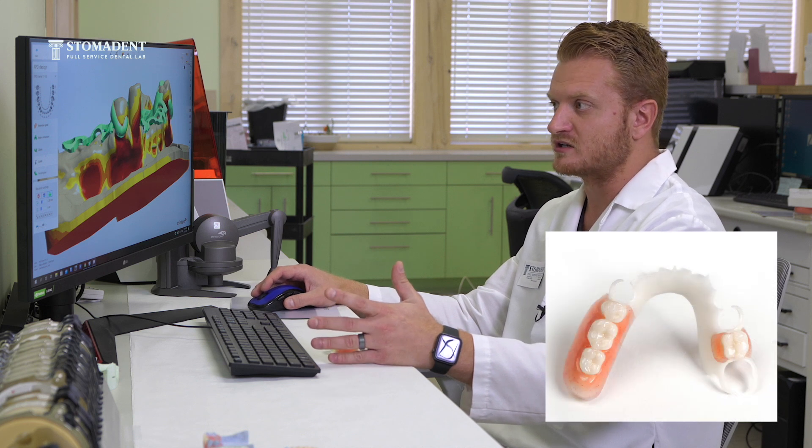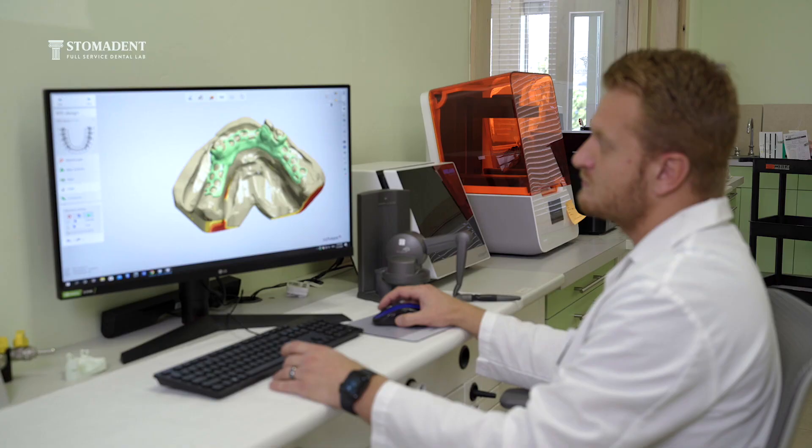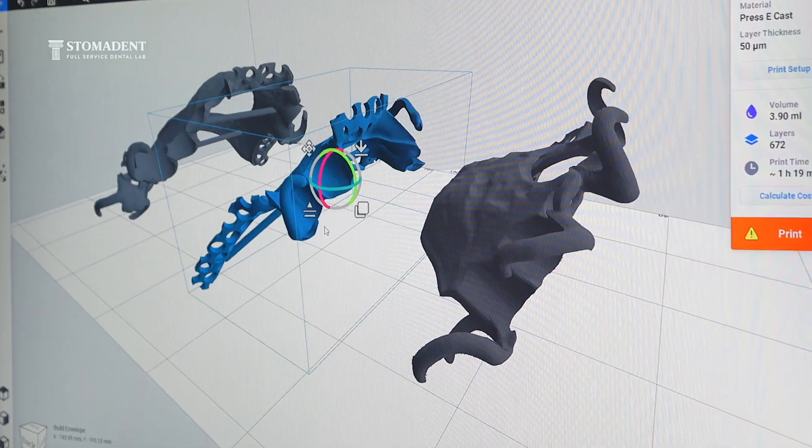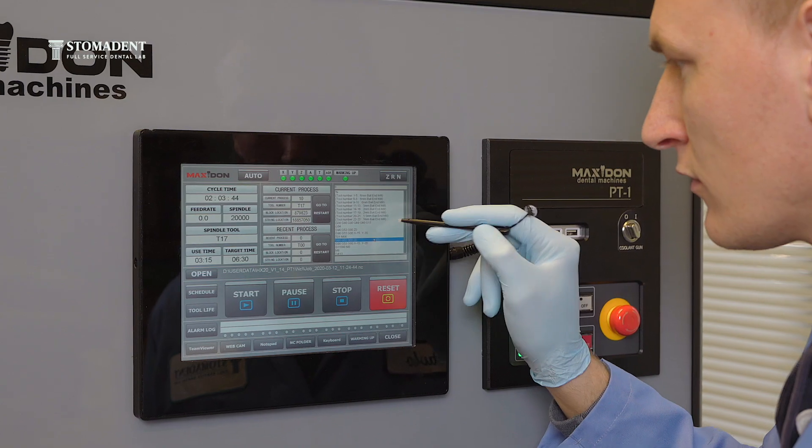Also at the same time, these acetal frameworks will be tooth colored, so they will be blending in with the tooth. I believe the best part about being able to design the acetal frameworks, as well as the metal frameworks and our titanium frameworks, is that we produce these frames here in-house.